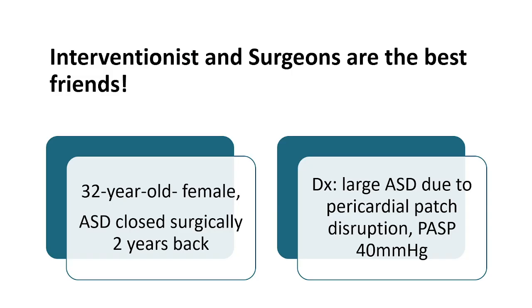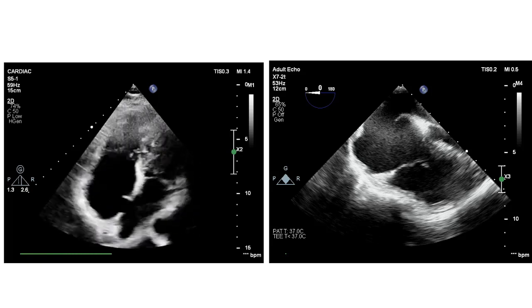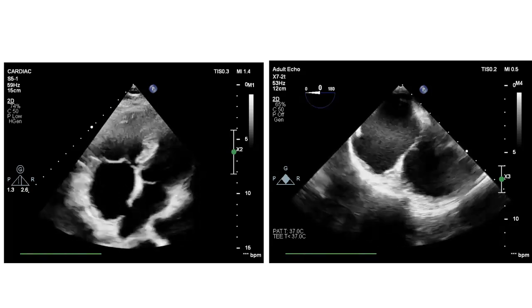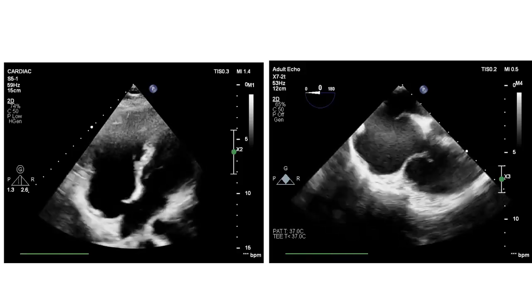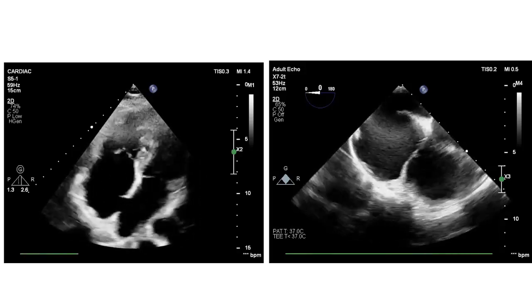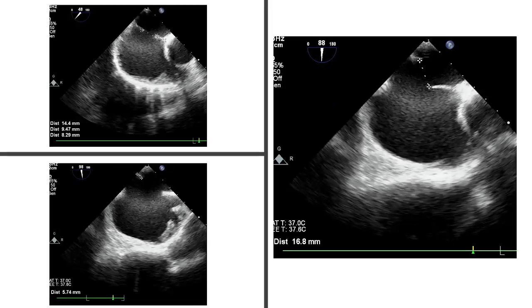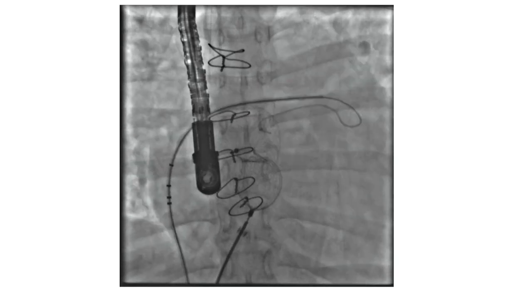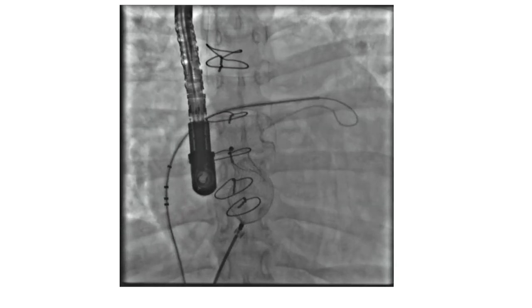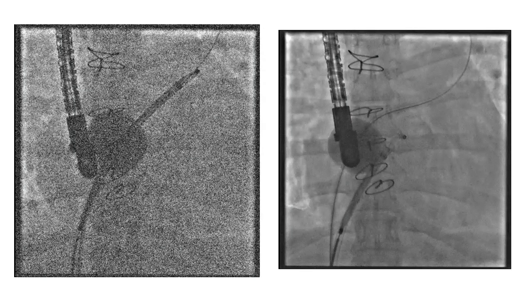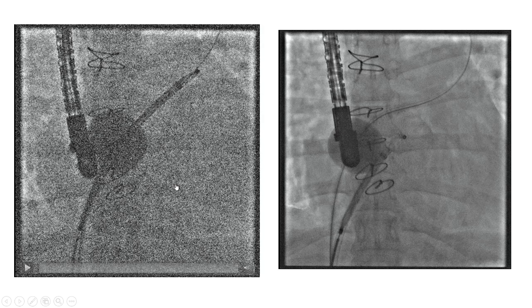The complexity of procedure: this is an unfortunate lady of 32 years who had ASD surgical closure two years back, but unfortunately there was disruption of the patch. We had some difficulties because there is malalignment of the rims, so we first tried catheter-assisted engagement but failed, then we tried the Boston Scientific Equalizer balloon.